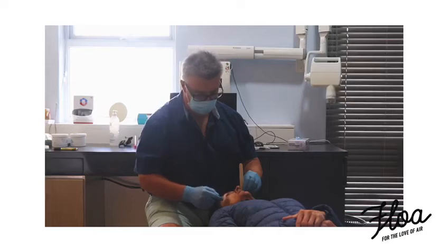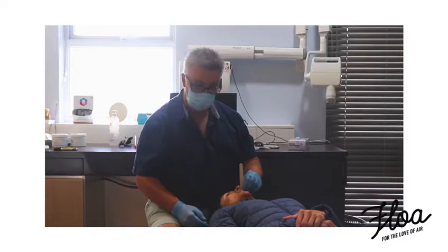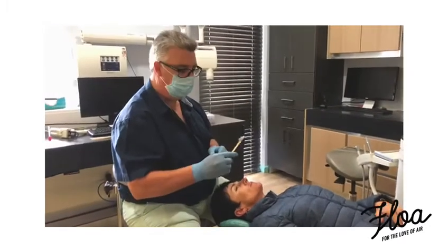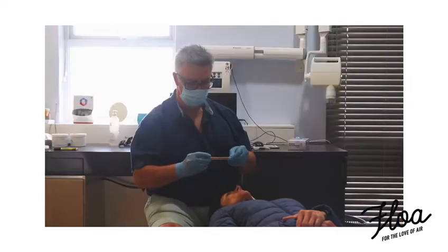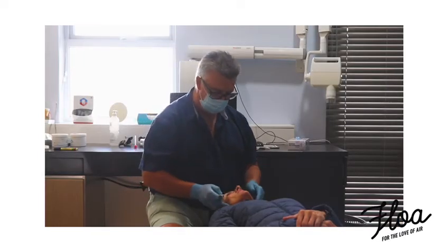Putty works well for these types of things, but you can use jet bite or any of the other materials as well — even temporary acrylic will work well. So now we've got a really nice stable stop on our little stick, and now we can start playing around and trying to get that position for the lower jaw.